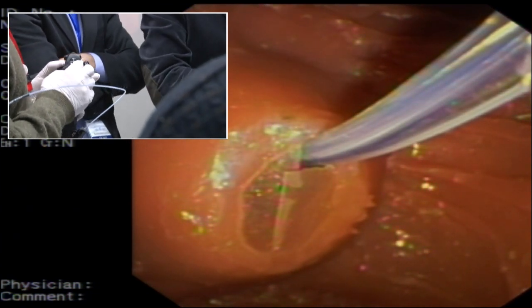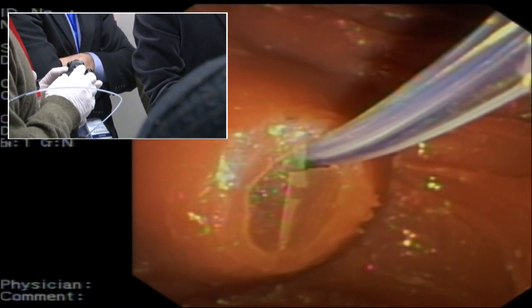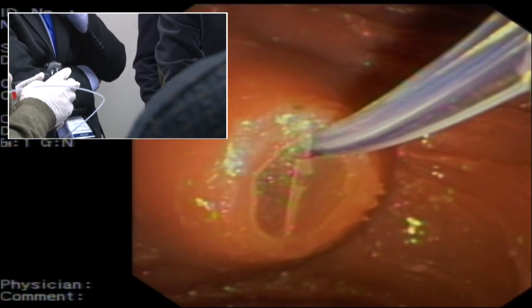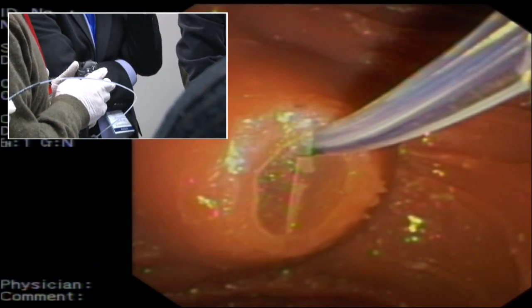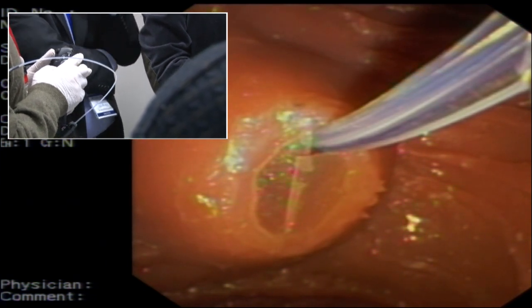But these movements actually are very important when you're dealing with a difficult case. Straightforward case is fine. But sometimes when you put in a difficult stent, you have to do pull back, big wheel up, elevator all at the same time. Okay, so you're now doing difficult cases, difficult strictures. The same thing applies.